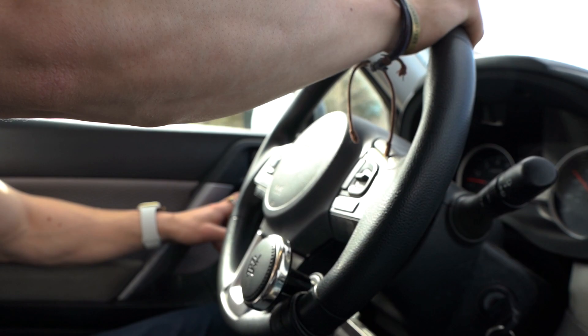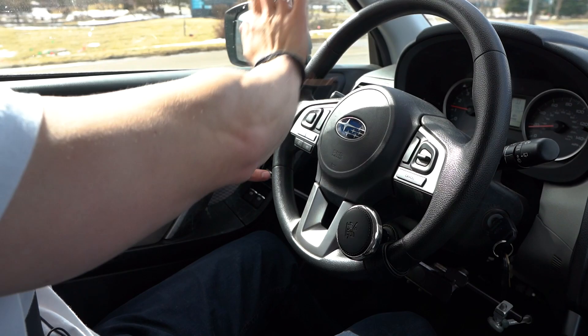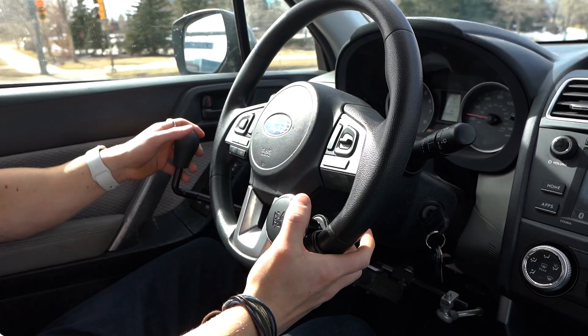I usually keep my hand down here, maybe up here. I only use the knob for turns, because when someone not using hand controls does a one-handed turn, they'll palm it around. But for me, palming it runs into this hand and becomes an issue. Being able to hold my hand on the knob here is nice — sometimes I'll just hook a finger in, but it's not as safe.